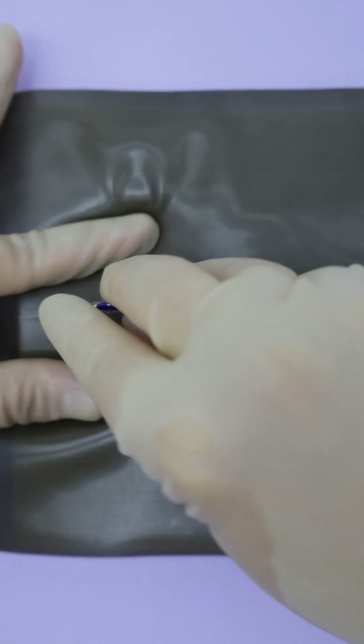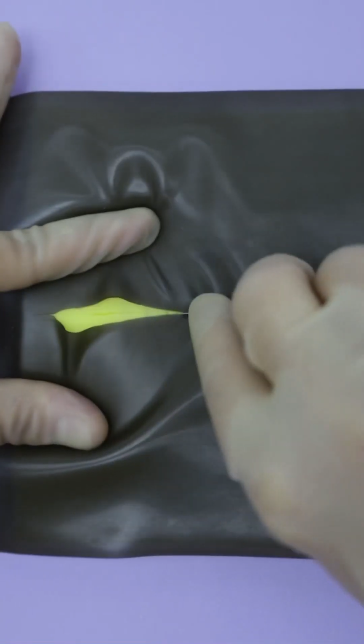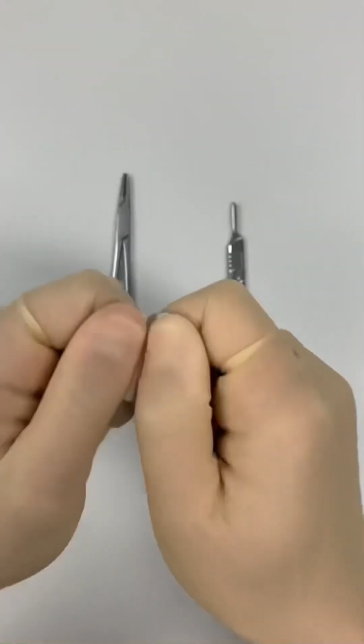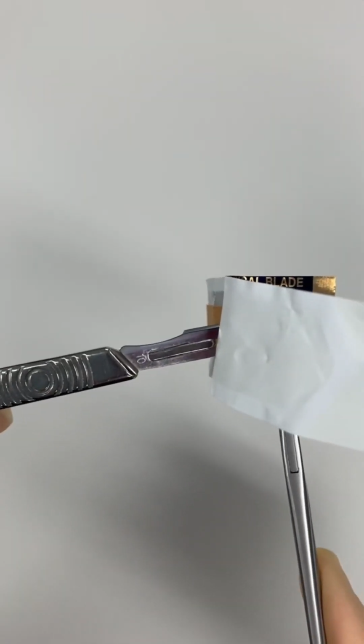Although it does take a few seconds to make, most of those seconds would inevitably be used for taking the blade out of the packaging anyways. So essentially it's like you're taking the blade out of the packaging and putting it on the handle at the same time.